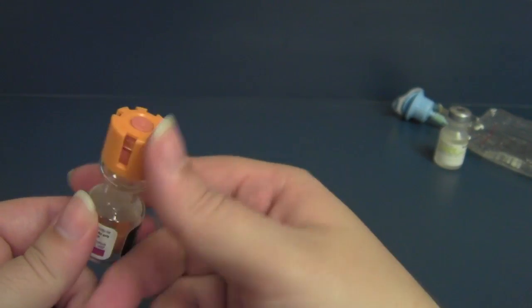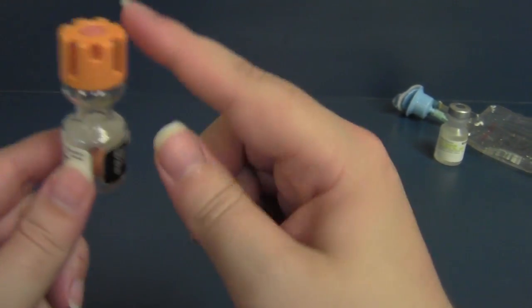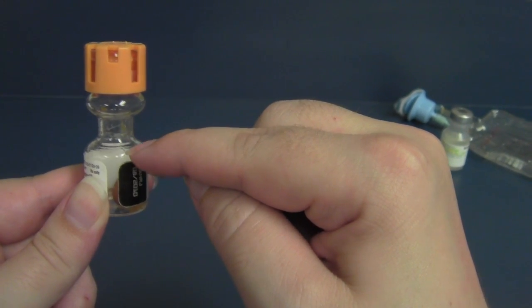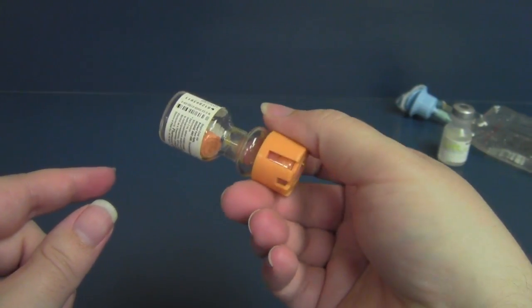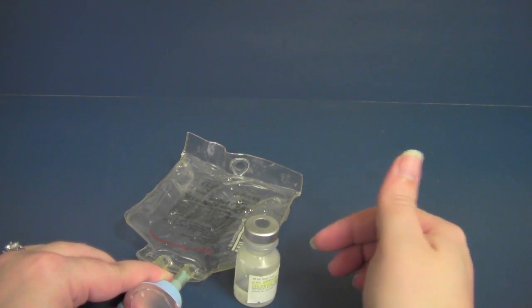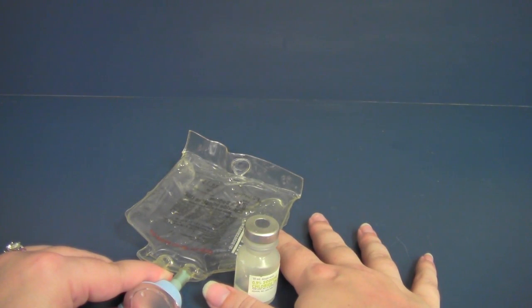And what you do is you push the top of this down, that creates pressure that then pops the stopper down into the bottom, and this lets the fluid down to the powder. You mix it up, and then you can draw it up directly from there. The last reconstitution that I want to review with you would be mixing antibiotics for IV administration.